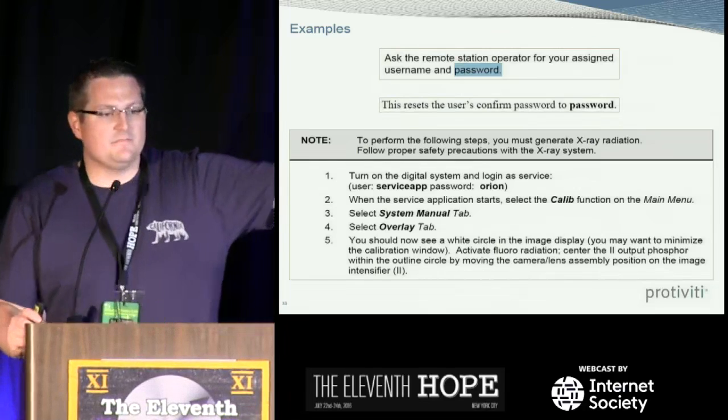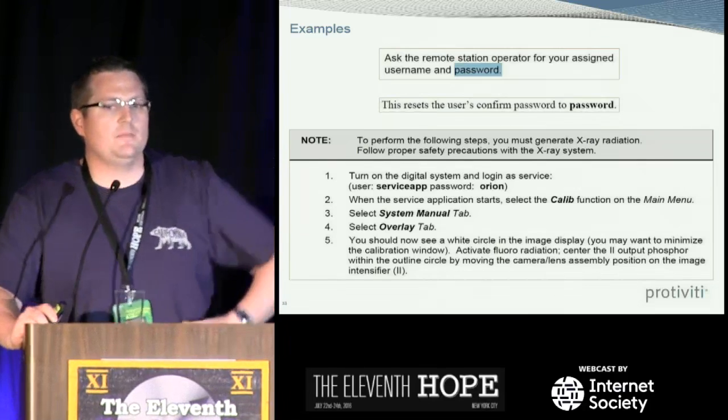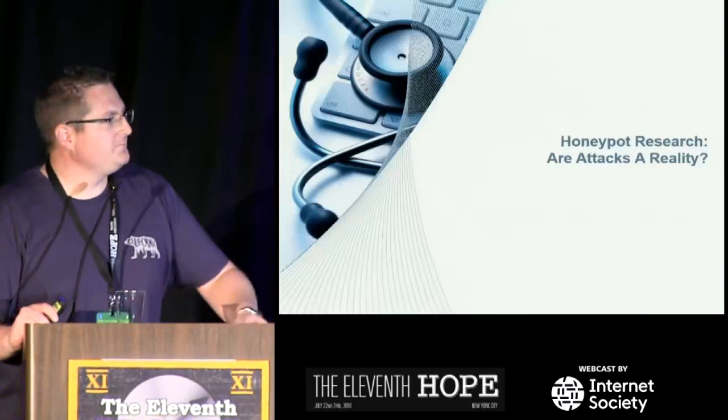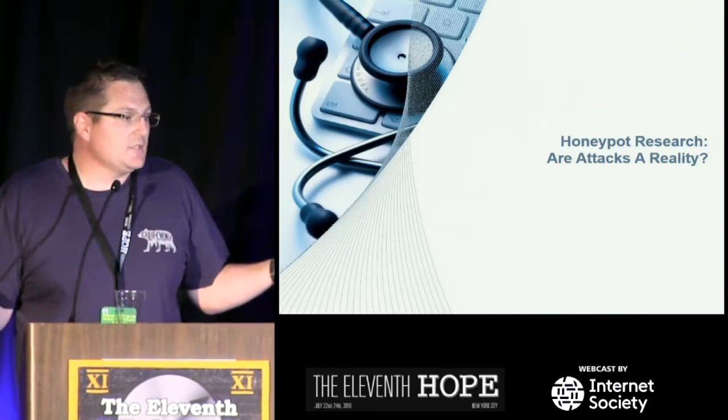This specific system, I haven't tested. I have done stuff exactly similar to this on other manufacturer systems, but that gives you an idea of how we try to find intentional use and then make it do something else. So we have vulnerable devices. They're connected to the internet. Not that difficult to get remote access.